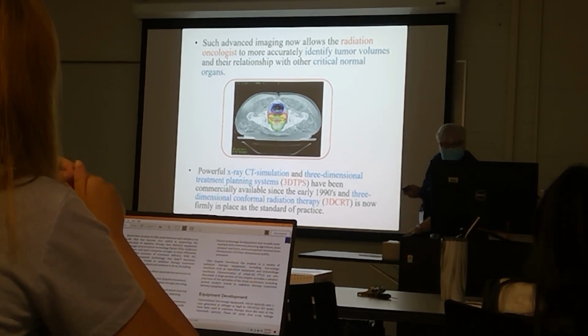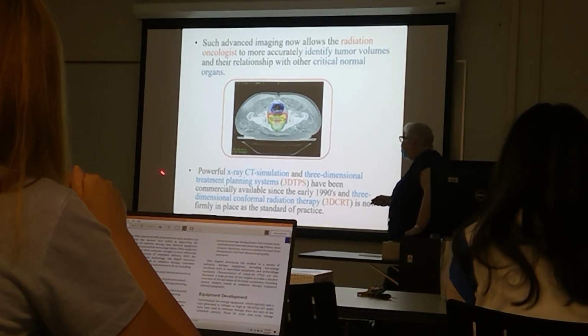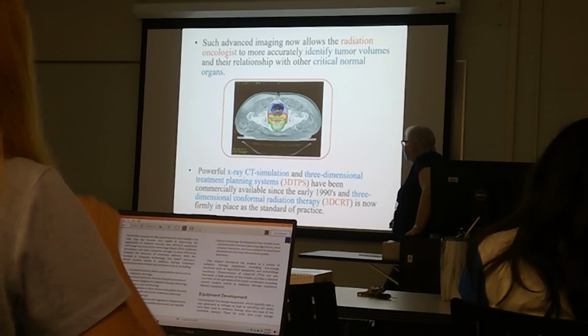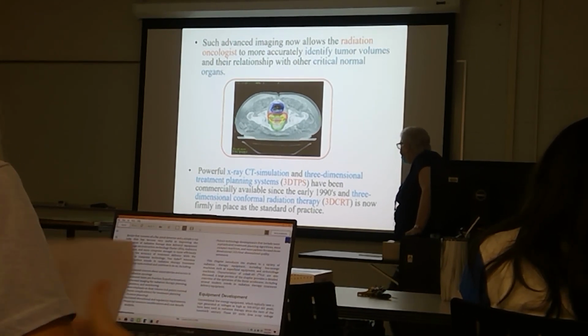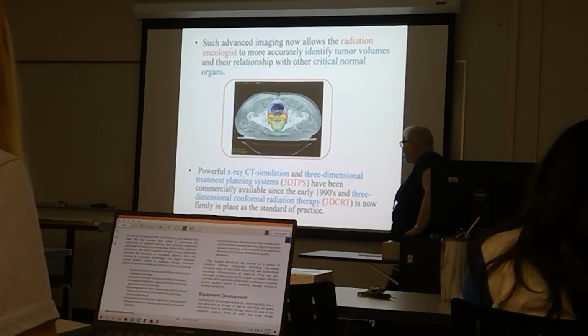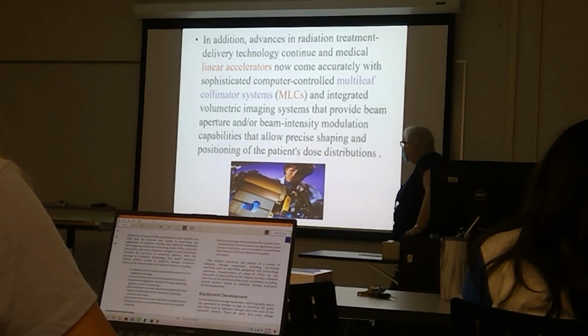So, CT simulation, 3D treatment planning system, commercially available into the early 1990s. It's now firmly in place.